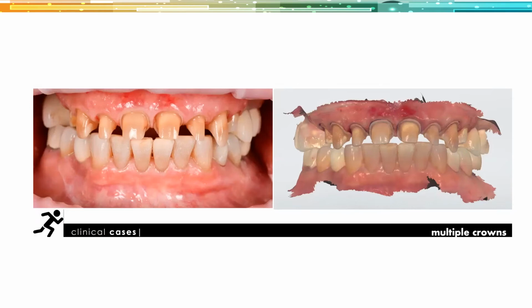Once the cord is set, I'm going to pull the cords and stitch in all the preparations. What I didn't mention yet is that when I do cases like this, I scan that mock-up as a pre-preparation scan. I scan all that information into the TRIOS. I capture the opposing arch and the two bites before I even start prepping the teeth. Then right before this, I use the trim tool to trim out number 5 to 12, and that's all I have to stitch back in. So when you see the preparations completed on the right, we gather the data in this segmental way, which is very stress-free.